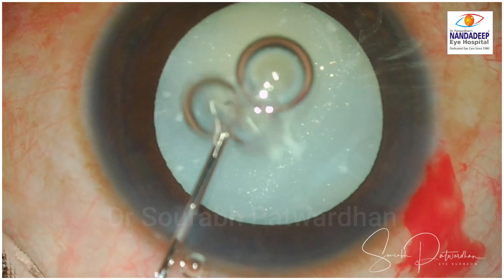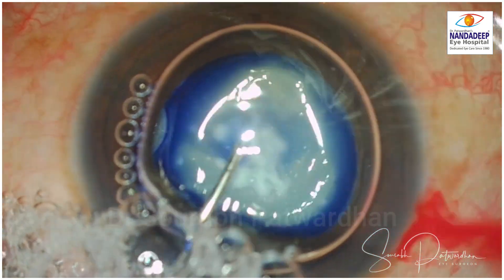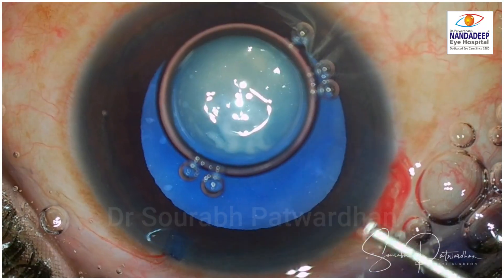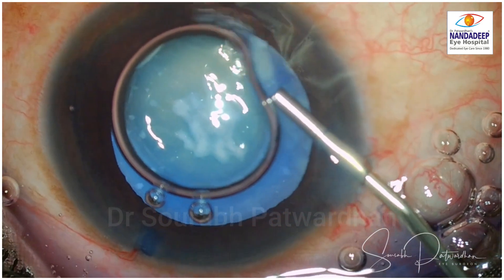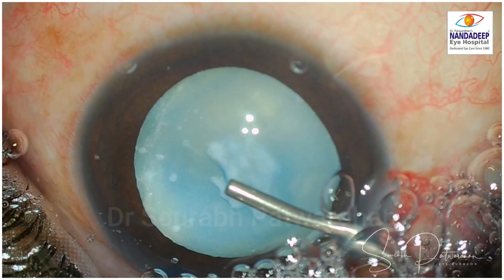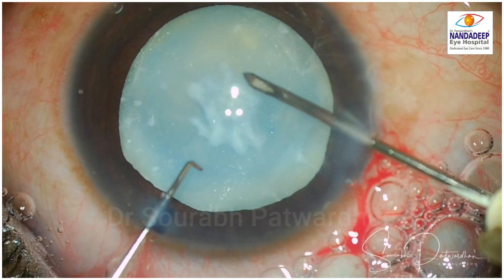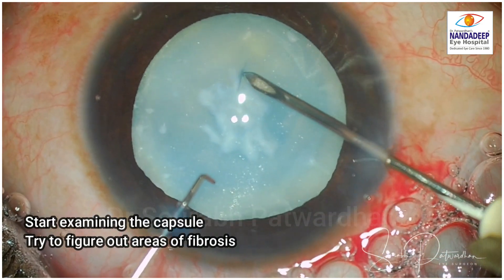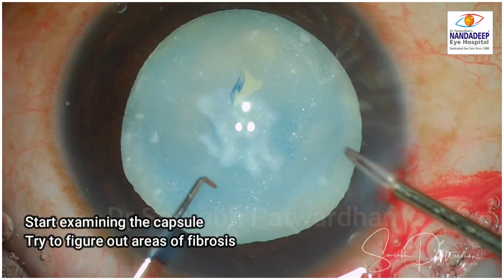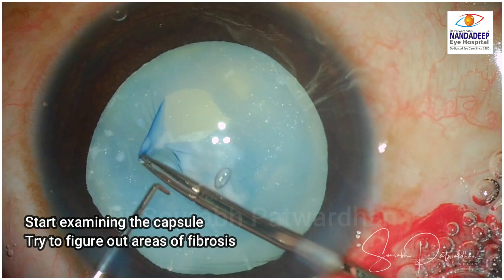Staining is very important because it is a white cataract and we need to have contrast when we are tackling this difficult capsule. We need to do a good staining, so stay for around 20-25 seconds after staining under air so that it stains the anterior capsule well. Now your mind should start examining the area of capsule and try to figure out which areas have fibrosis and which are probably free of fibrosis.